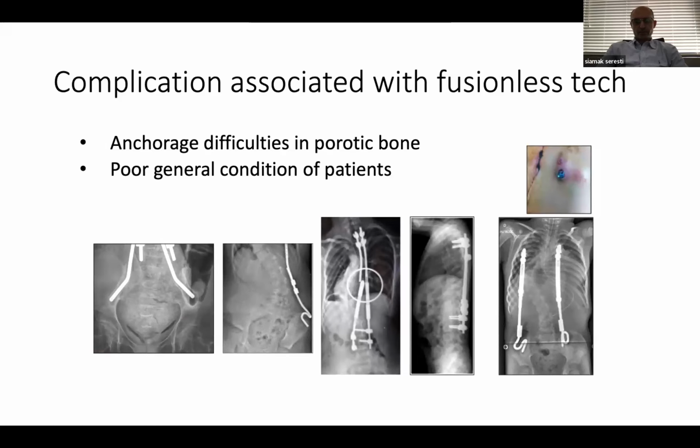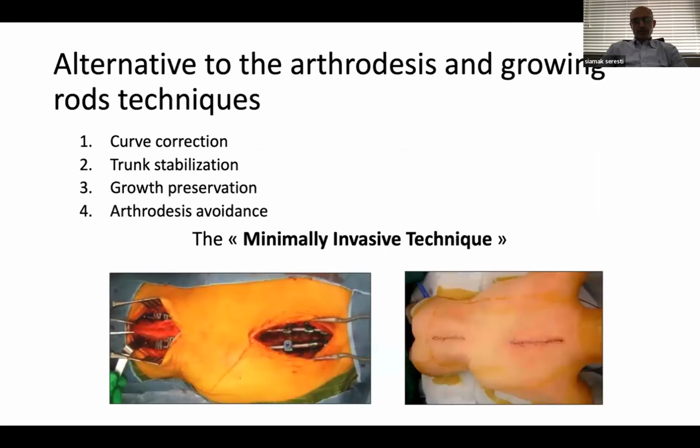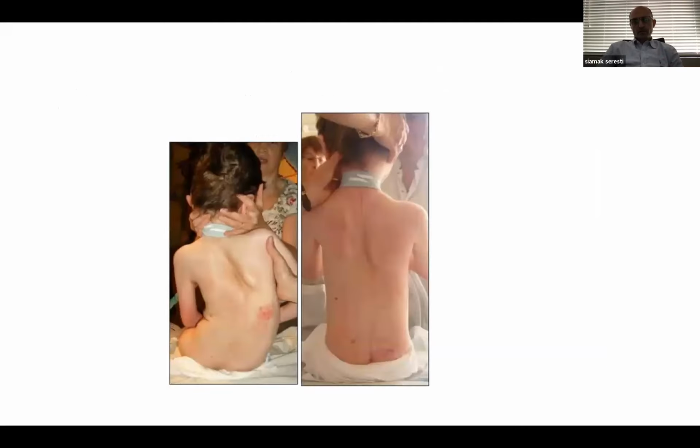any with the neuromuscular. The technique I want to talk about, we call it minimally invasive because we don't open up the whole spine. We just open up the bottom to put the anchorage into the pelvis and also the top part to put our hooks. It usually provides good sitting balance. We try to avoid any scarring in between, and the complication rates such as infection are a lot lower than the standard neuromuscular scoliosis surgeries.